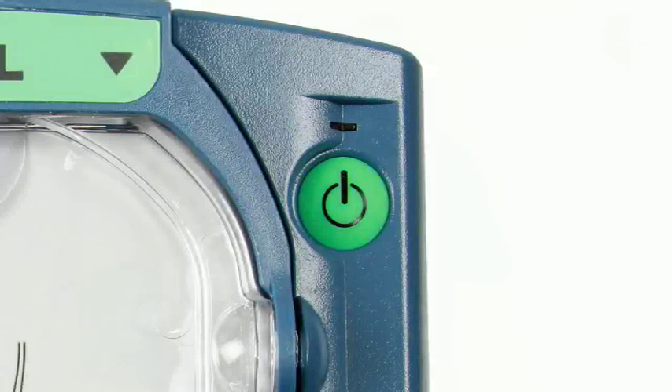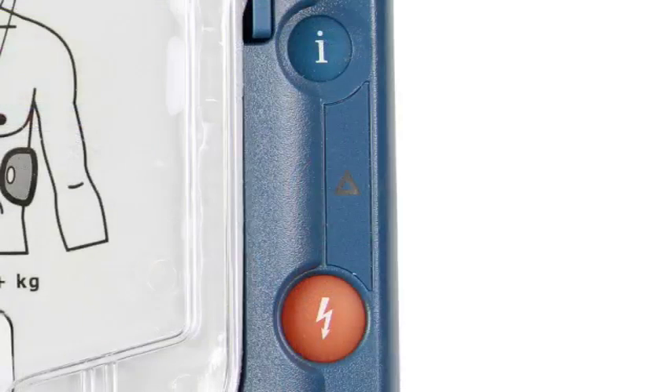The power button can be used at any time to activate or deactivate the defib unit. The caution triangle located between the info button and shock button will flash to indicate that the defib unit is analysing the patient's heart rhythm and that no one should touch the patient.